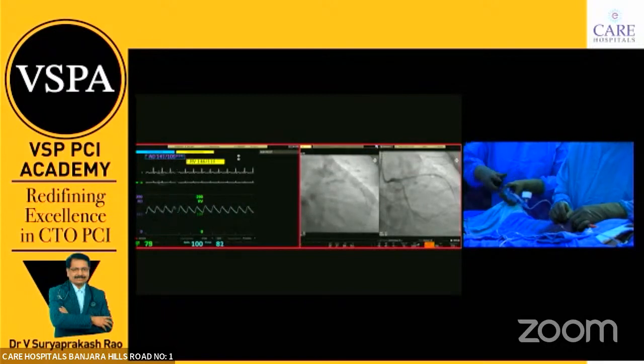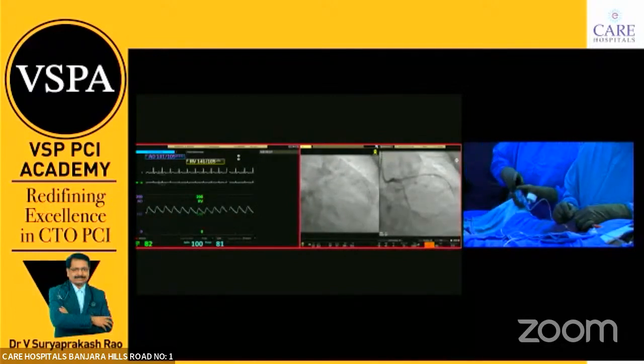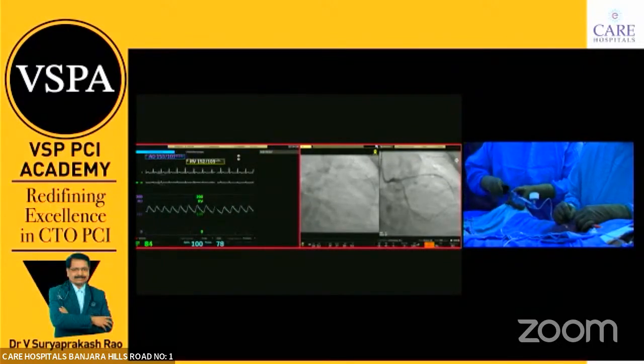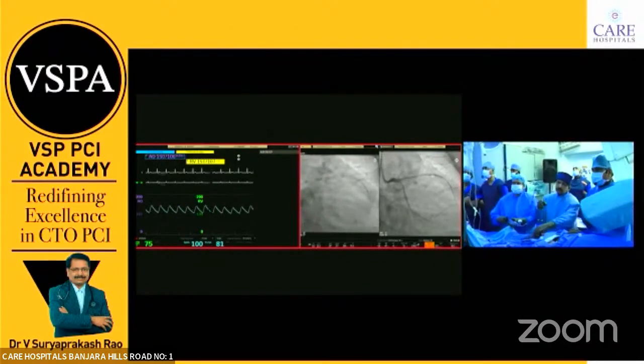Okay. Expand here. 20, 22. Do it here, you go to 24. 20, 22, 24. You can see a stent boost here. Then we'll come out.